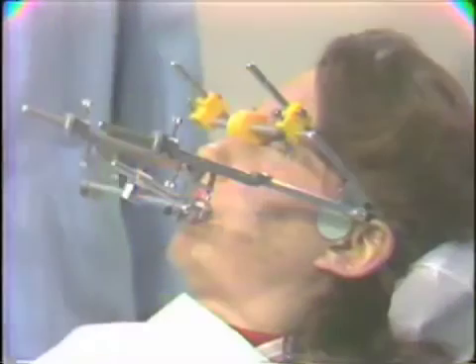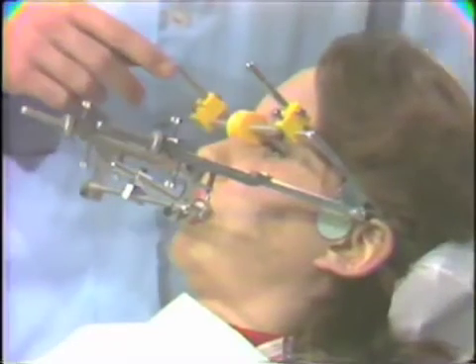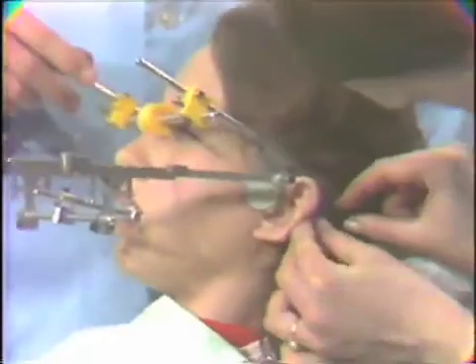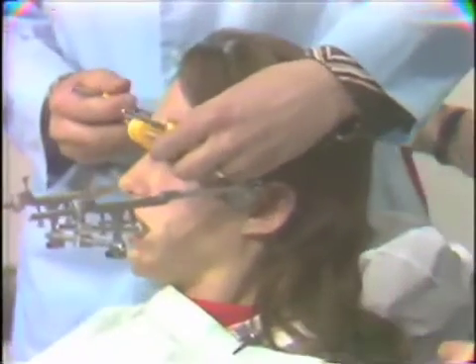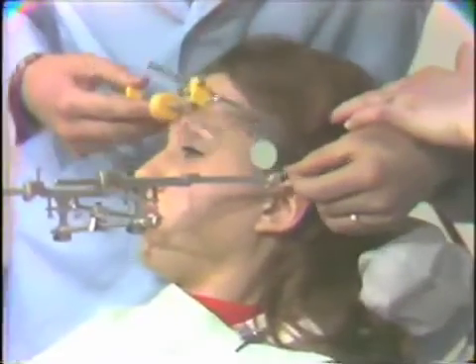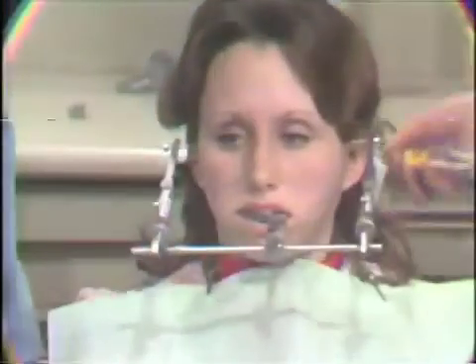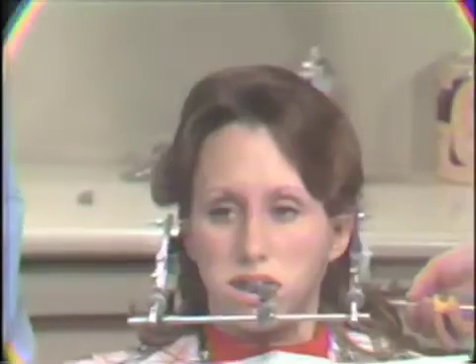Once this is found, we remove the upper member, which contains the grid, and we can now mark the hinge axis on the patient. First of all, we want to seat the patient in an upright position. And we're now ready to do the markings.